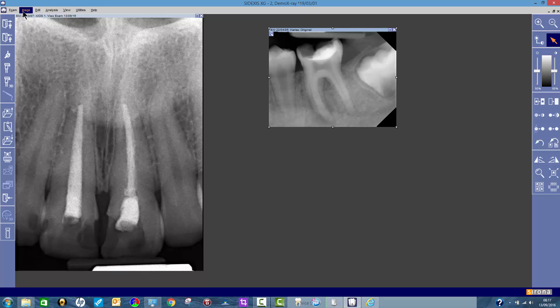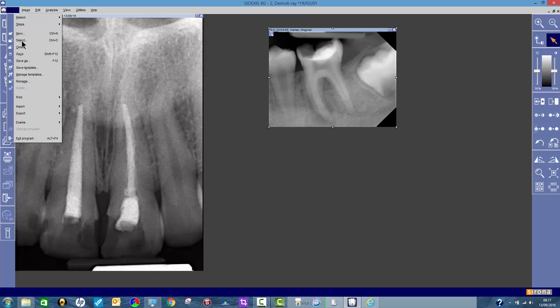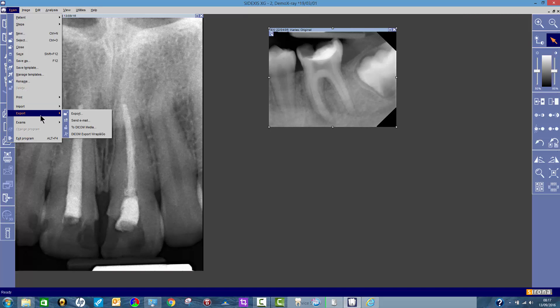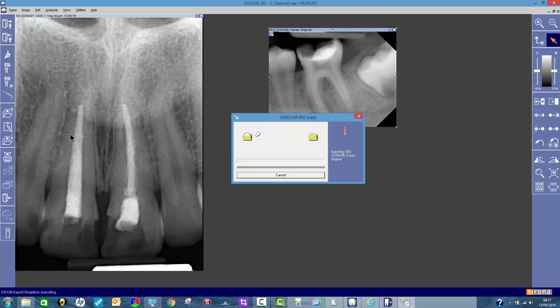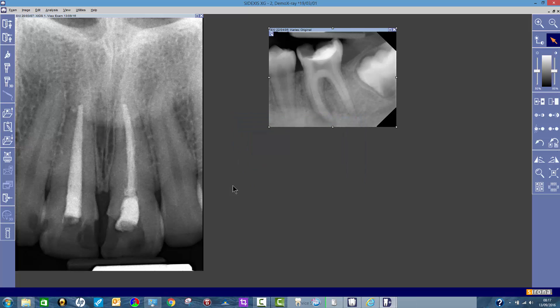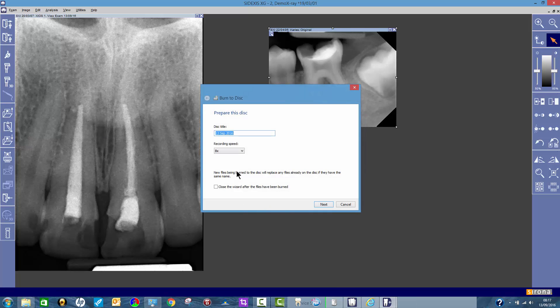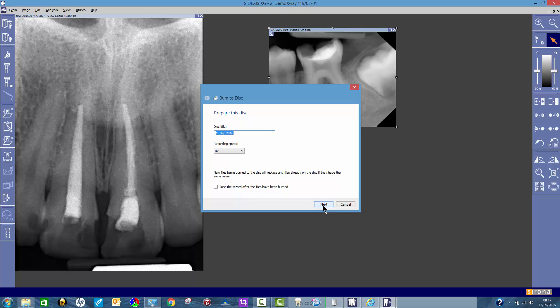Then what I'm going to do is click on exam, export, DICOM export wrap and go. Then it talks me through it. What do I want to call it? I could call it the name of the patient for example. I'll just click on next.